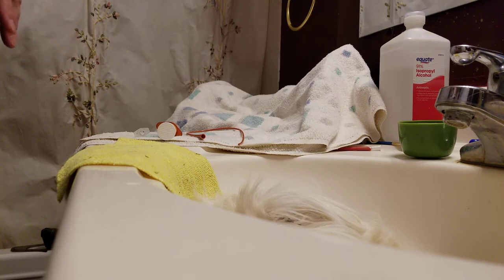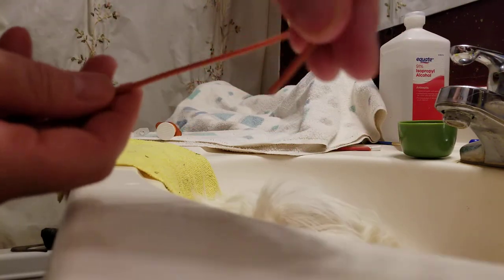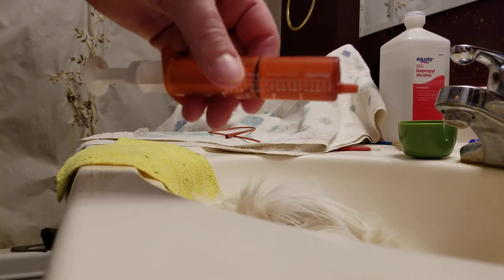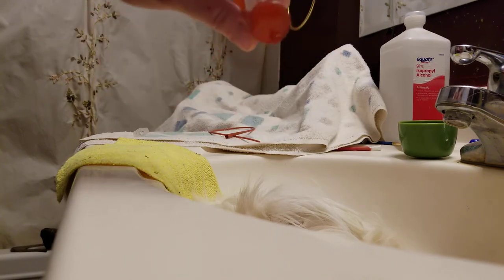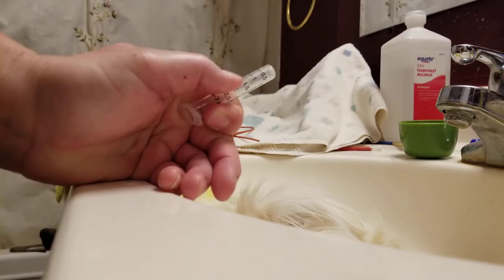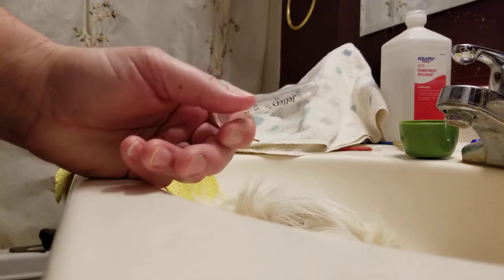This may not be for everybody, but for anyone who has been interested in knowing how to do this — first off, what I'm going to be using: this is an adult guinea pig. I'm using a feeding tube, which can also be sold as a catheter. It's a size 8 FR — FR8 is what I'm using. I've already got my syringe; right now I'm just giving fluids, otherwise I give critical care or whatever else I may need. I've got my electrolytes — I'm actually using coconut water with vitamin C here. You're also going to need some type of gag. What I'm using is just a 3cc syringe casing, and this is going to keep the mouth from biting down, because you don't want the guinea pig to bite down on the catheter — otherwise they're going to put holes in it, or you risk them actually snapping it in half, and then you're stuck with a feeding tube inside the guinea pig.